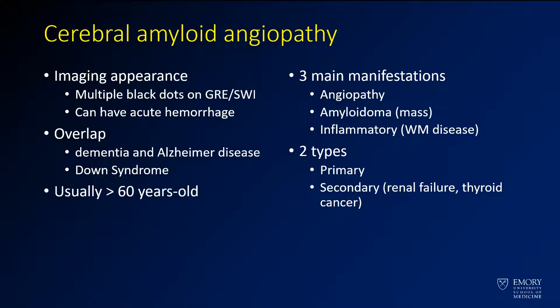The imaging appearance we've seen: multiple peripheral areas of hemosiderosis on gradient susceptibility imaging. There's a great deal of overlap between dementia, Alzheimer's disease, and Down syndrome. Usually these patients are greater than 60 years old. For cerebral amyloid disease, there are really three types to think about. The one we're seeing here is the angiopathy, which is essentially vasculitis associated with amyloid.